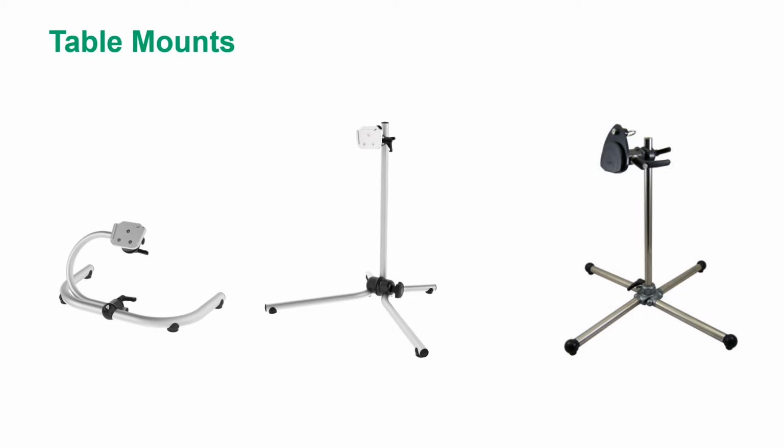In many cases, table mounts are preferred in situations where the mount must be used in multiple locations or must be frequently moved. They are often lightweight and easy to carry, yet they are quite sturdy. Table mounts can hold the AAC device upright, flat, or at a tilt angle.